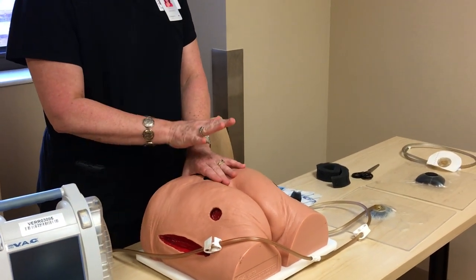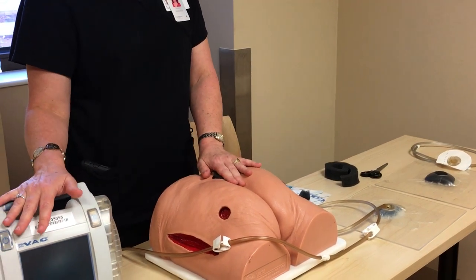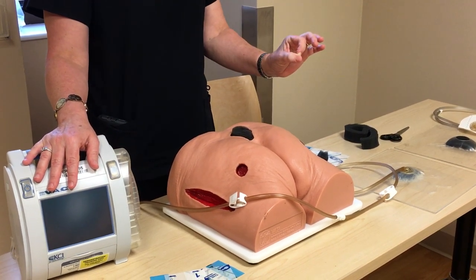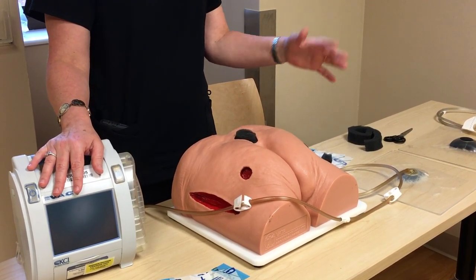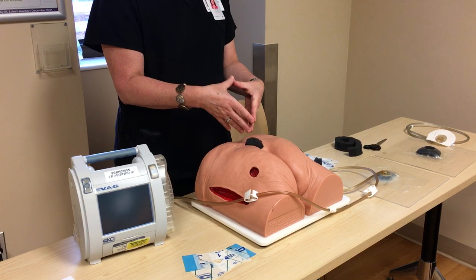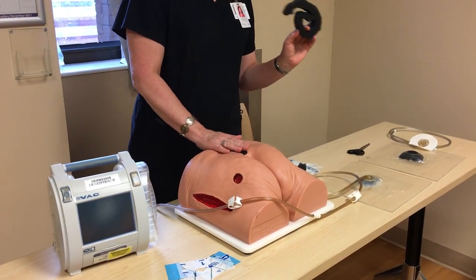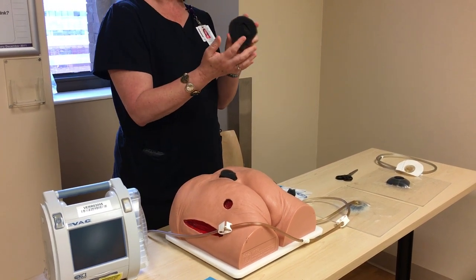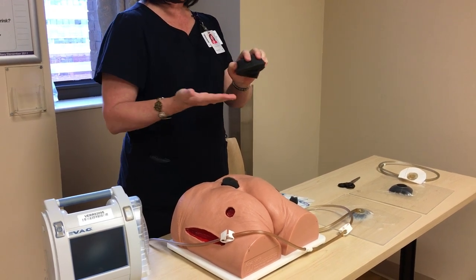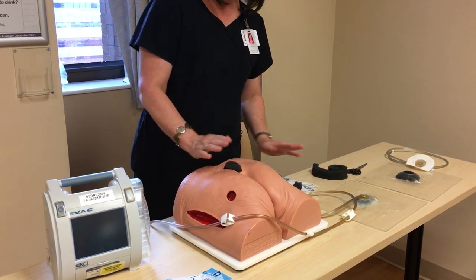The other thing that's really important with VAC is that the dressing not be in place and hooked up to the VAC without negative pressure being applied to the wound — two hours maximum in a 24-hour period. So if something goes wrong in the middle of the night or during the day and you lose your seal or get an alarm, it's very important that you take care of that alarm right away, because this foam does not absorb drainage. It's about 80% air with an open pore size, so if it's just sitting in the wound and not hooked up to suction, all of that infectious material is sitting in the wound bed, and after a couple of hours it starts growing things.